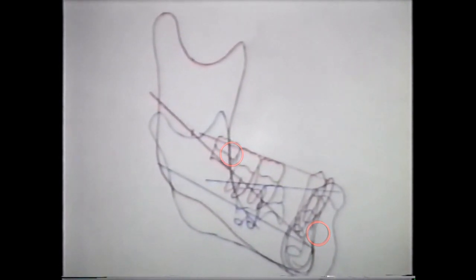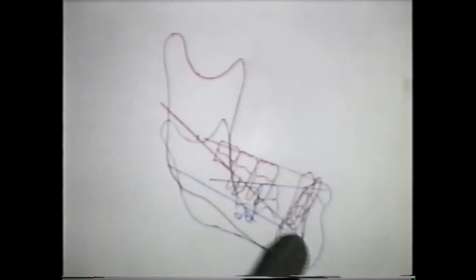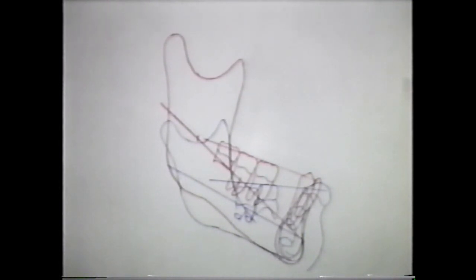Now the next thing then is to see how the mandible is really growing, and in order to do that we superimpose on PM and on the anterior border of the ramus rather than the lower border of the ramus. We now use PM and the anterior border of the ramus. That comes very close to simulating the arcial growth of the mandible normally. Now you see what the lower denture is truly doing to true bone. And you notice how the lower arch moves upward and forward. As the mandible grows on an arc, there's progressively more space for the third molar.